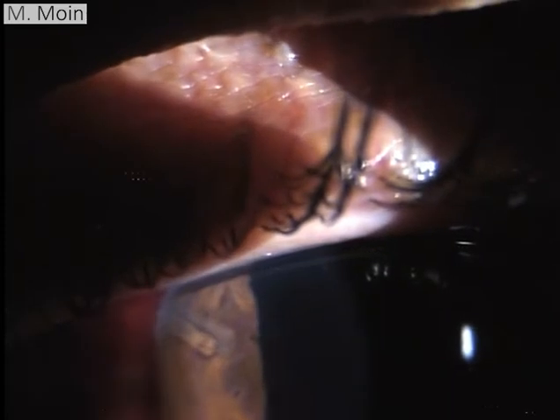Welcome to this video of anterior segment examination on a slit lamp. Here we're going to show you a patient who is post Ahmed glaucoma valve surgery.